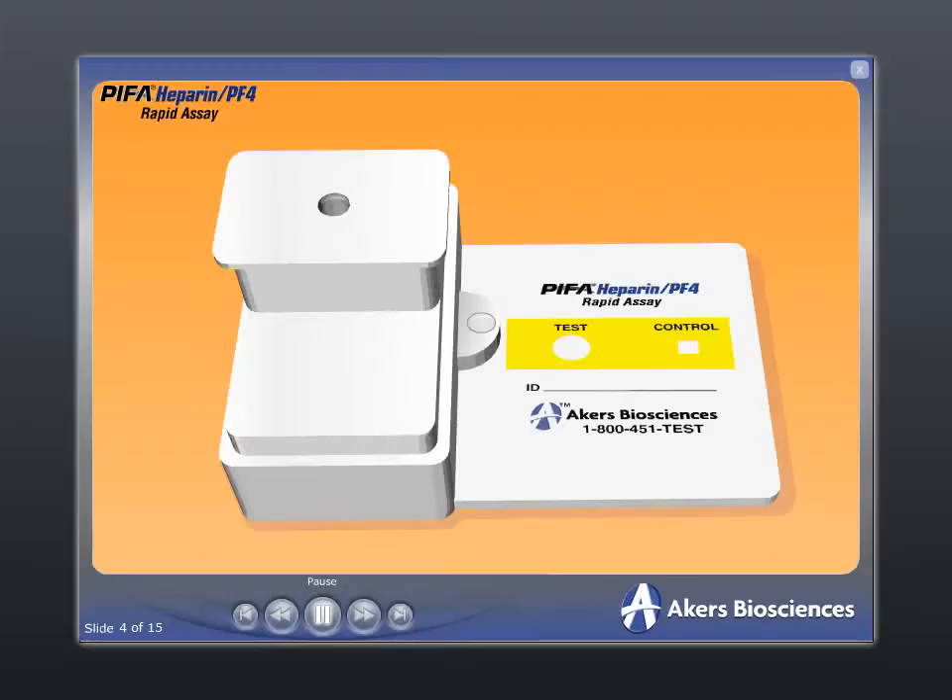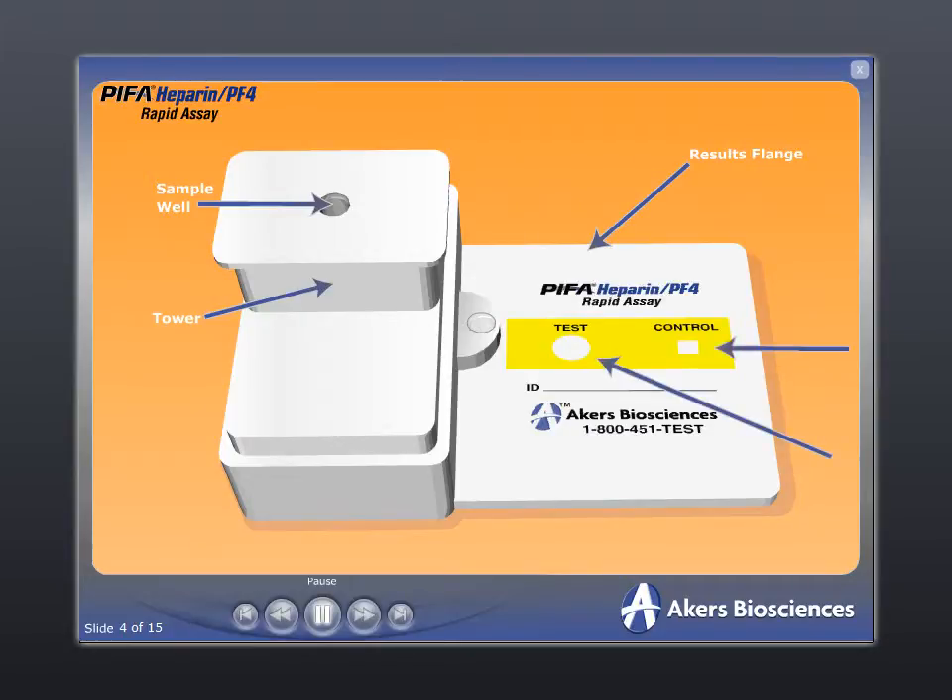The Pypha Heparin PF4 Rapid Assay is a mini-reactor device that consists of a push-button reagent dispensing system referred to as the tower and a results flange. The tower houses the sample well, microparticle-based reagents, and a reaction chamber. The results flange contains the Pypha membrane filtration system and test, control, and reagent windows.